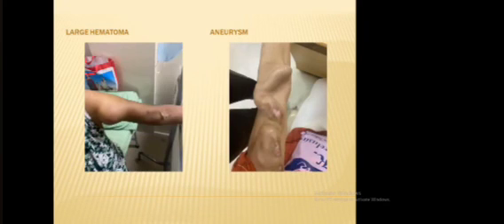This patient was referred from an outside center in Chalakudi. She came with a large hematoma, and after this hematoma she was not doing dialysis through the fistula. A jugular catheter was placed and dialysis was done through the jugular. After surgical treatment of the hematoma, revision surgery of the AVF was done and she is doing dialysis through the AVF again.